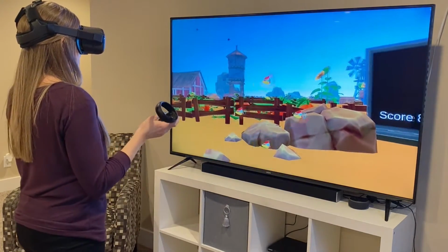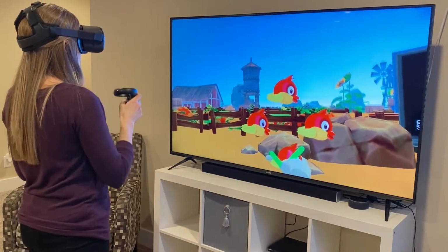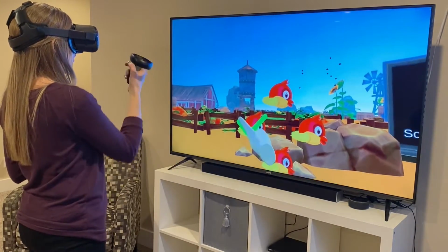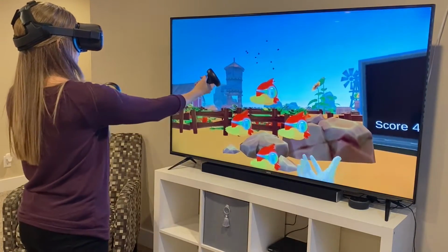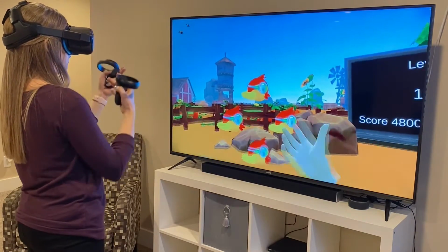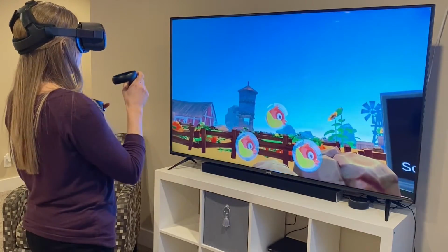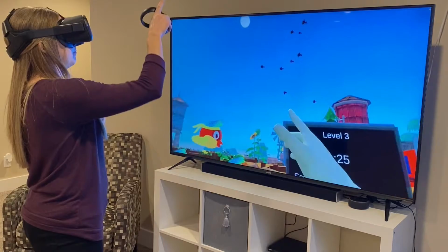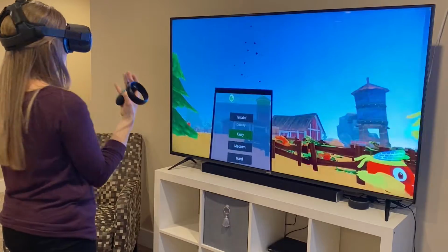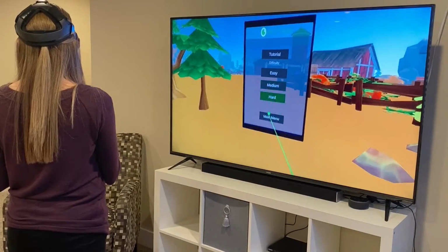So now the purpose is to just touch whichever bird is closest. Now, in the beginning, it's super easy, right? I can tell pretty easily. But as it gets more difficult, I love having these hands because I can interact. I can try to go behind the bird and see that depth. I can go in front, and so I'm always looking for the space and the depth, which is really cool in this game. I really love that. Another great part of this game, this is my favorite, is the birds in the sky. Do you see those? So to me, I can make those appear three-dimensional, which is really cool. So that's Tappy Birds. Let me go back to the main menu.